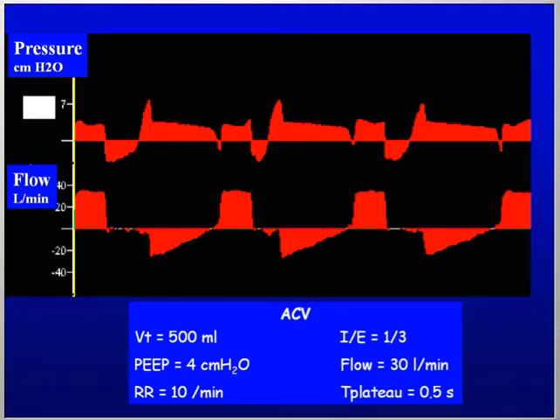But if you do that, if you change the inspiratory flow for the same tidal volume, you also change the inspiratory time. And then comes another interaction with the patient, which is not only the beginning of inspiration, but also the end of inspiration. And this is just a funny example to illustrate a problem we had in our ICU. For instance, this is a tracing of pressure, this is a tracing of flow.